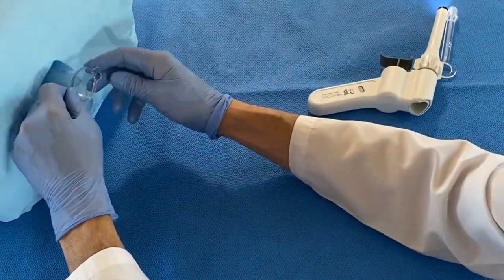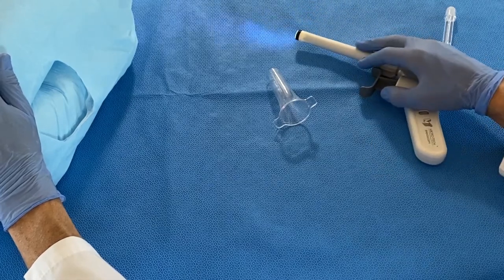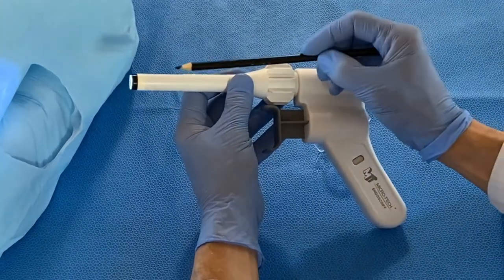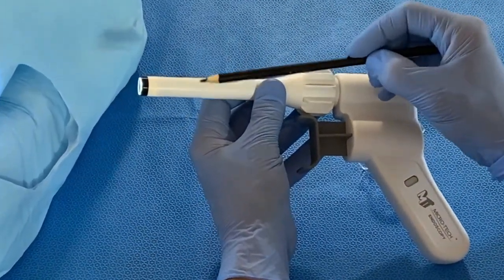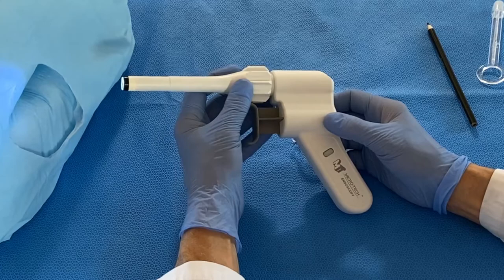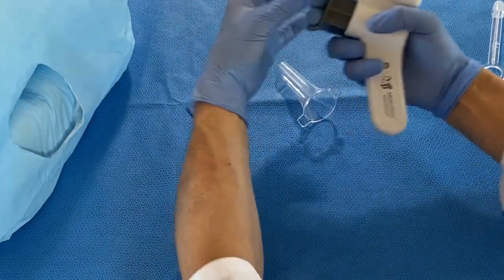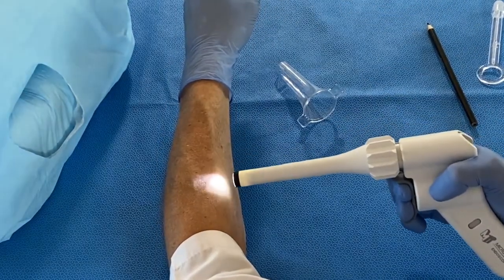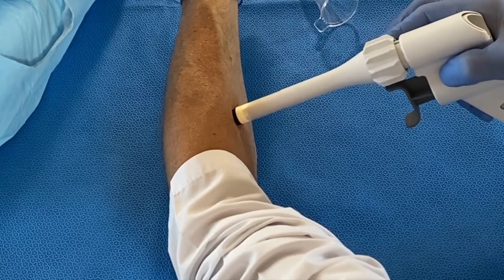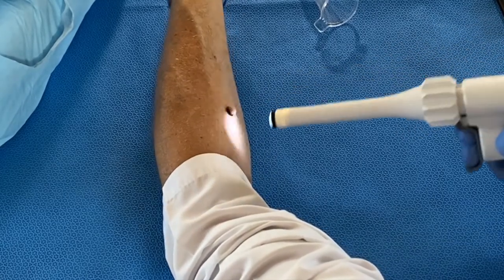Then remove the anoscope and perform rectal examination to document proper band placement. If you would like to ligate blindly, you can use the groove on the outer tube as a guide for band placement. Pull the trigger to create suction, approximate at the desired location, release the trigger to suction the tissue in, and rotate the outer tube 180 degrees to release the band. Repeat as needed.